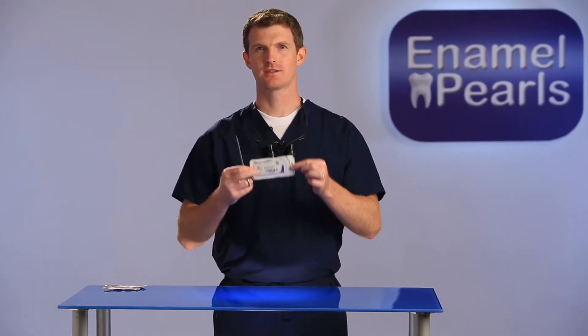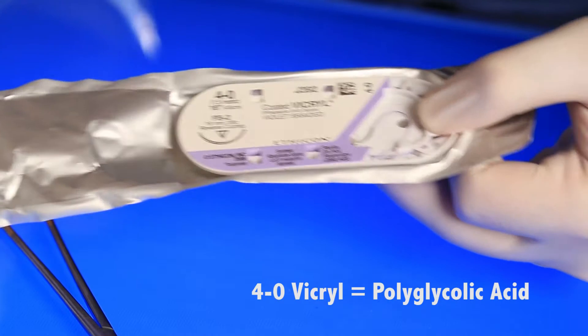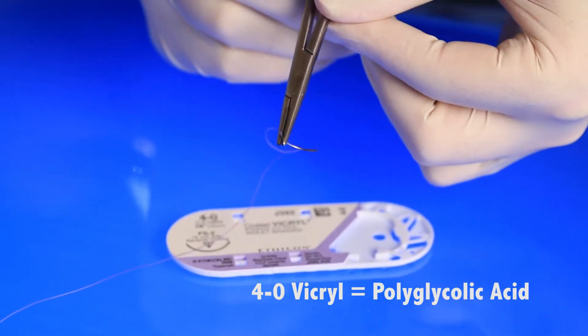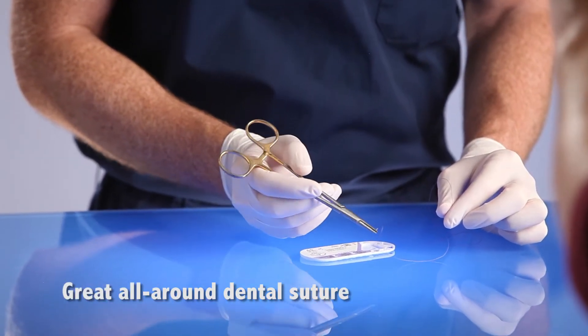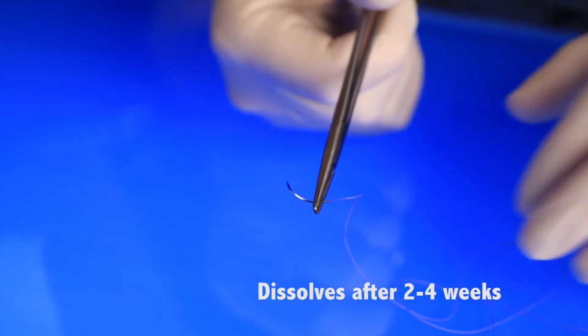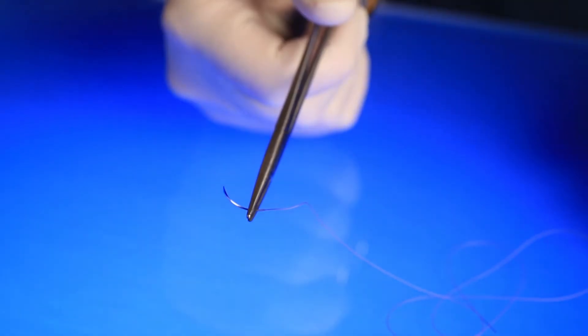4-0 Vicryl, polyglycolic acid, is commonly known as Vicryl. Vicryl is a go-to suture for almost any situation. It can be used for flap surgeries, ridge augmentation, suturing extraction sockets, and around implants. The suture dissolves but very slowly — takes more than four weeks. My favorite needle for 4-0 Vicryl is the FS2 Ethicon because it passes easily interproximately, holds its point, and is very durable. Vicryl ties nicely and holds its strength the first 14 days.